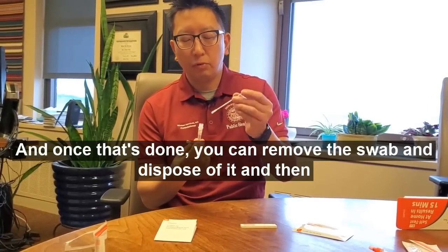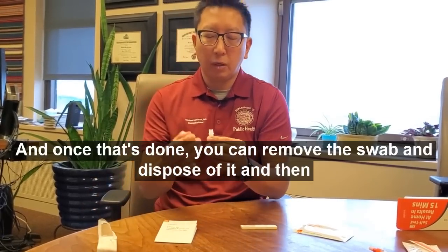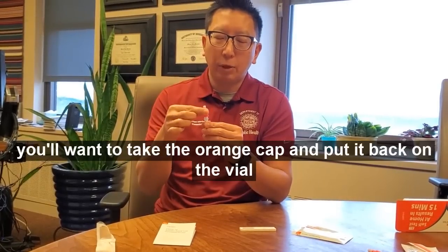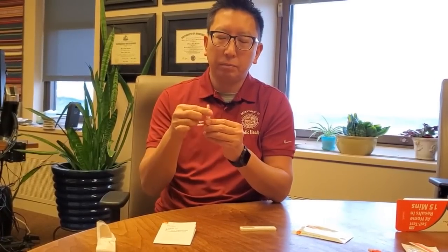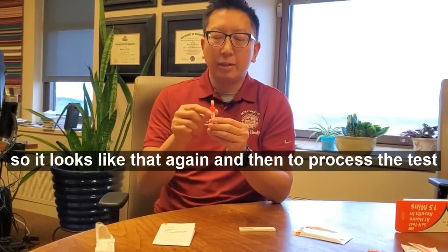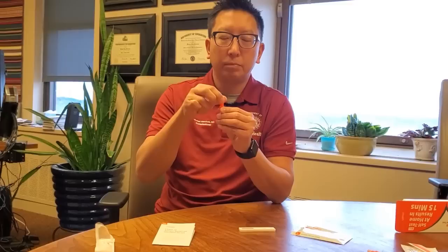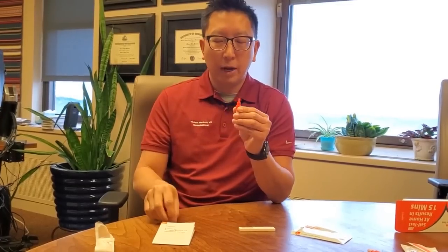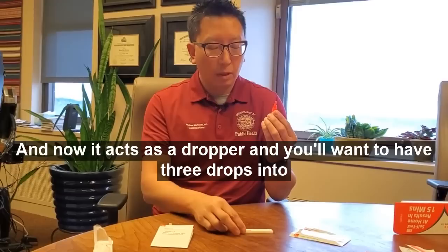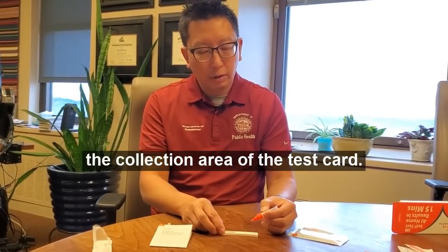Once that's done, remove the swab and dispose of it. Take the orange cap and put it back on the vial. Then to process the test, take the white cap off the top — now it acts as a dropper. Add three drops into the collection area of the test card.